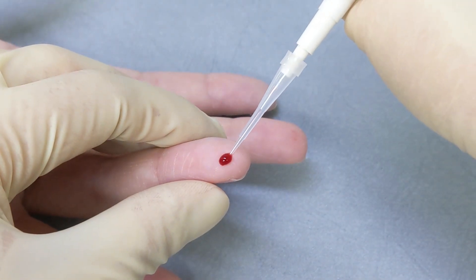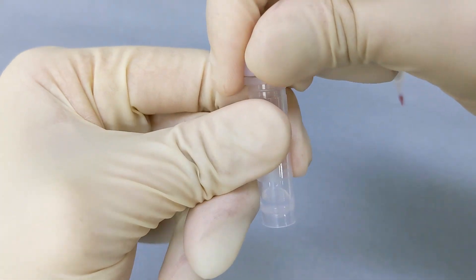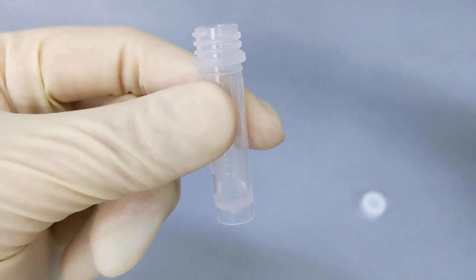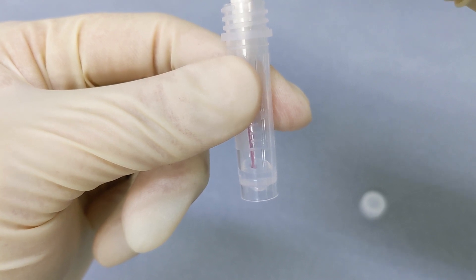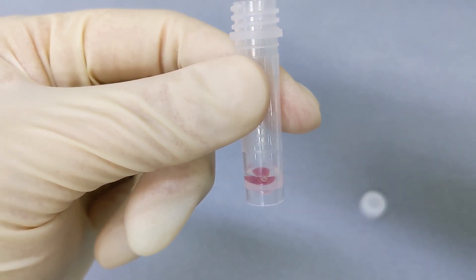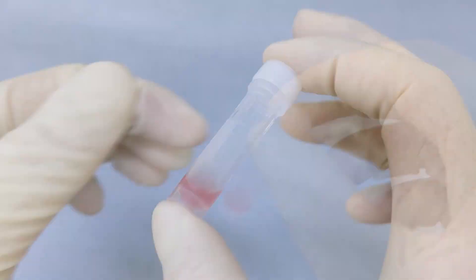Take 5 microliters of the finger blood with the micropipette. Mix 5 microliters of the collected whole blood evenly with the drying reagent in the reagent tube and avoid bubbles in the sample. Shake horizontally a minimum of 10 times.